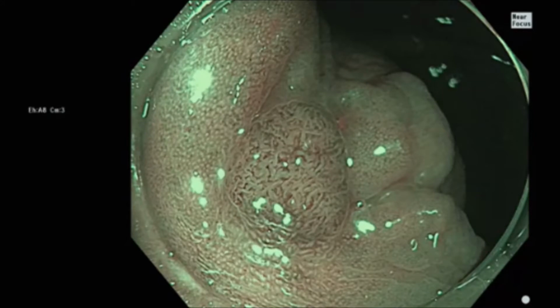And just as when we looked at the previous EMR report to help determine the location of the scar, so we want to look at the previous pathology report to determine if the lesion was adenomatous or serrated, because we're going to be looking for different types of pits depending on the original histology of the lesion.